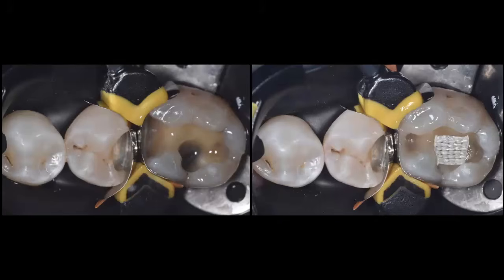Before all this, I had cleaned both teeth with my AquaCare system. Then I rinsed and dried, did my selective enamel etching, and rinsed the etchant. Then I applied chlorhexidine, dried it, and then applied my primer and adhesive and light cured. Then I do my resin coating layer, and I'm always going to do a horizontal layer first.